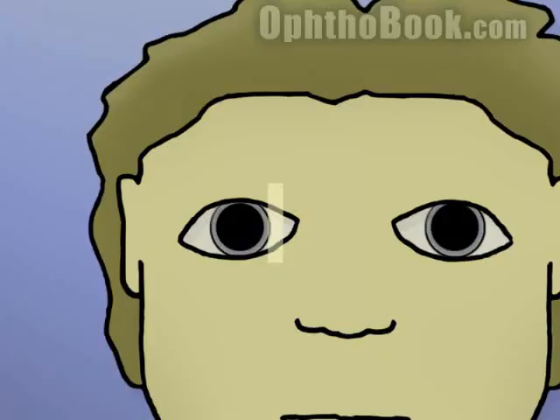So what does this look like? Here's our light. As you pass it in front of the eye, you can see that red reflex — the line you're seeing in the background inside the eye. It looks a lot like the light source and goes in the same direction, so we know things aren't in focus. No matter what direction you move your light, it's always going in the same direction — that's what we call 'with' movement.